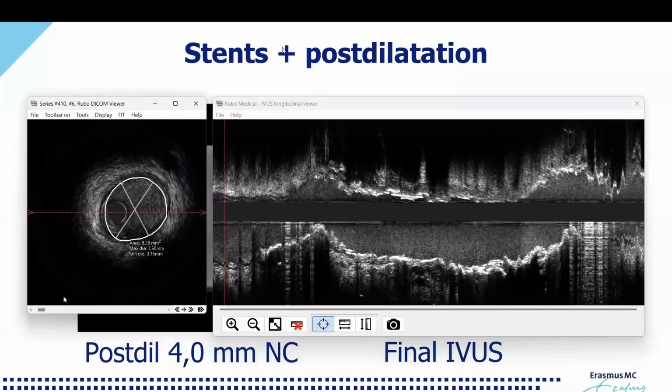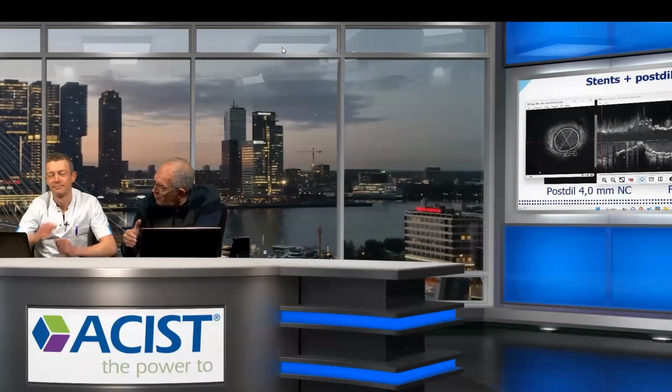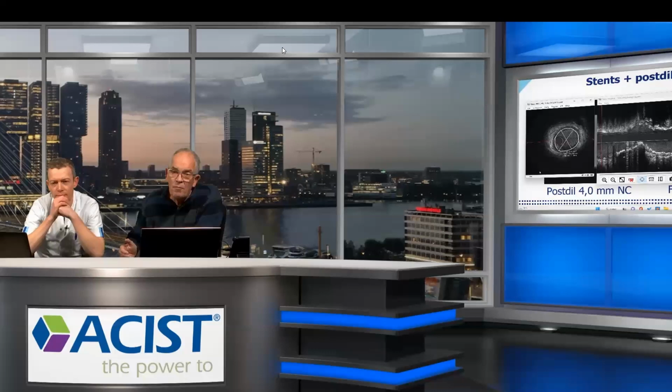When I was still young, two guys found this: with less than 50% plaque burden, the remodeling is such that even your lumen size increased a bit or stayed the same. Glagov was a pathologist. He found it first, that was before IVUS, and then Hermiller checked his work with IVUS and found exactly the same. So forget this. I don't want to be rude again, but forget the EEM if you have less than 50% plaque burden. I would not forget about it.